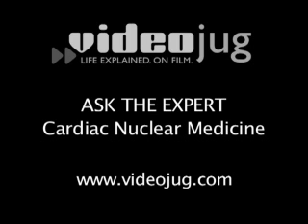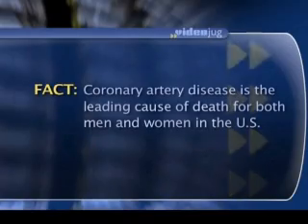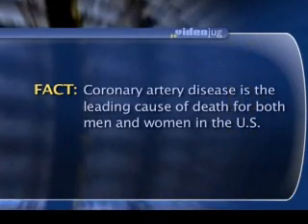Cardiac nuclear medicine. What is cardiac nuclear medicine? Cardiac nuclear medicine is basically used to diagnose diseases of the heart. The two major areas are detection of what we call myocardial ischemia, and that is shortage of the blood to the heart muscle in relation to coronary artery disease. And the second major area is in detection of myocardial viability.